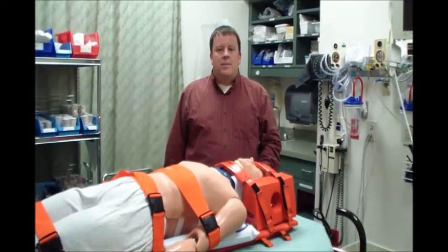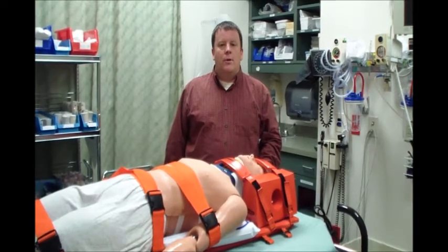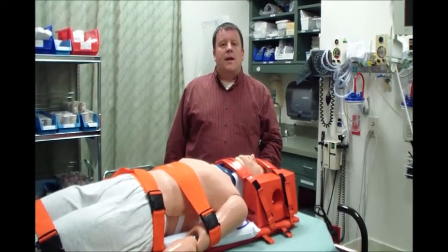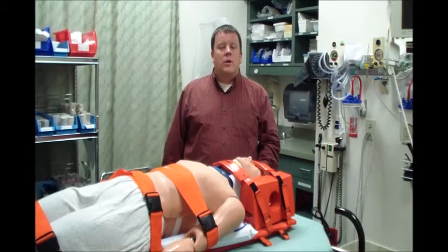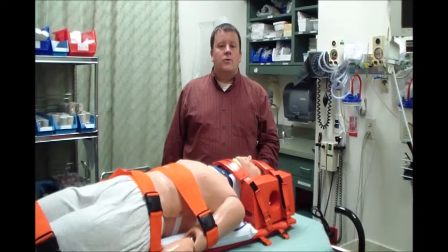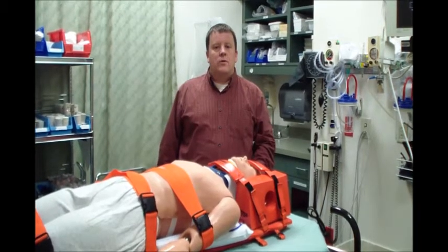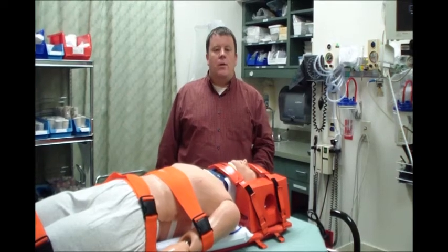The tissue changes that become pressure ulcers begin in as little as 20 minutes of being on a hard backboard. We've provided each level 3 and 4 hospital in our region with a supply of the Thomas Back Raft and a few of the hand pumps. All we ask is that when you are transferring a trauma patient to a higher level trauma center and they're still on a backboard, to document the patient's skin condition before transfer and use some form of padding, such as the Thomas Back Raft, on the board.